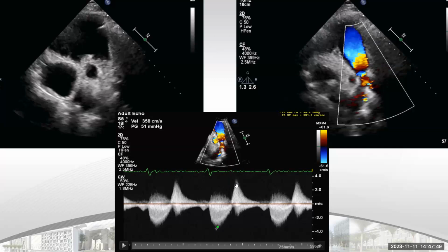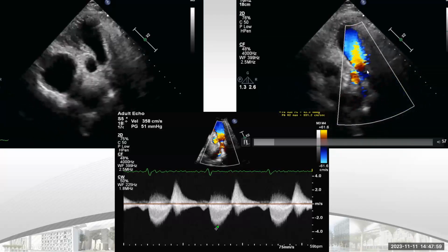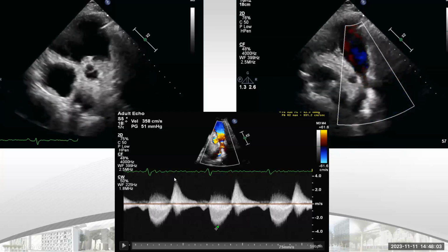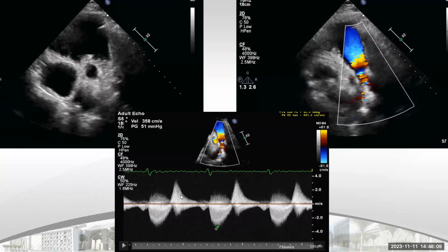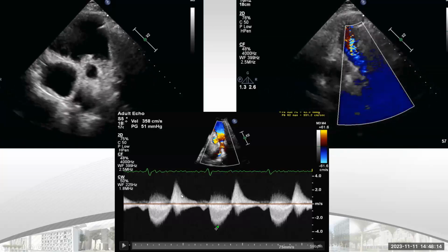What about the regurgitation? Is it severe, moderate or mild? Moderate PS, severe PR. Yes. Why severe PR? As I said, in color flow you have a very wide vena contracta, and the jet fills most of the RVOT. You can see here the triangular shape of the pulmonary regurgitation jet. This is CW across the pulmonary valve, so this is the jet of pulmonary regurgitation.